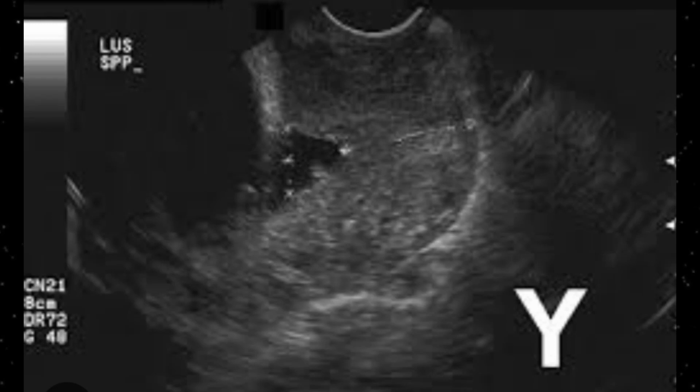So far as this case is concerned, it has clearly shown that this is a mild case of cervical incompetence. Only one point is present for the cervical incompetence, and that is only internal os dilatation. So the internal os is dilated more than 4 millimeter. If you put that in your report, it will help towards the management.